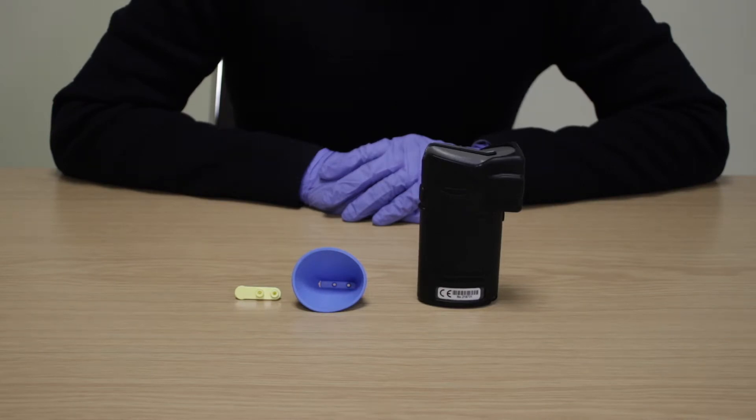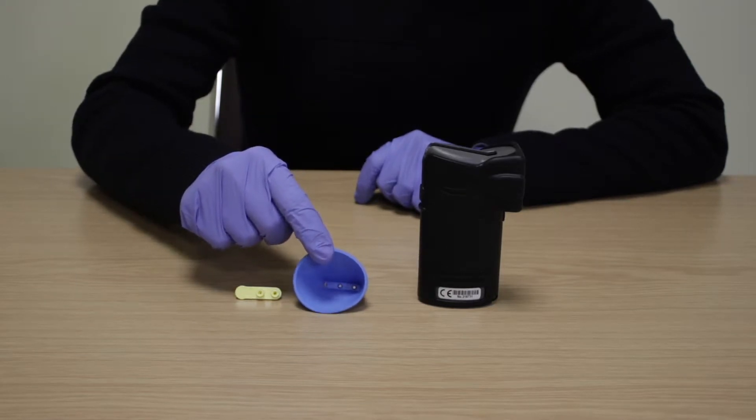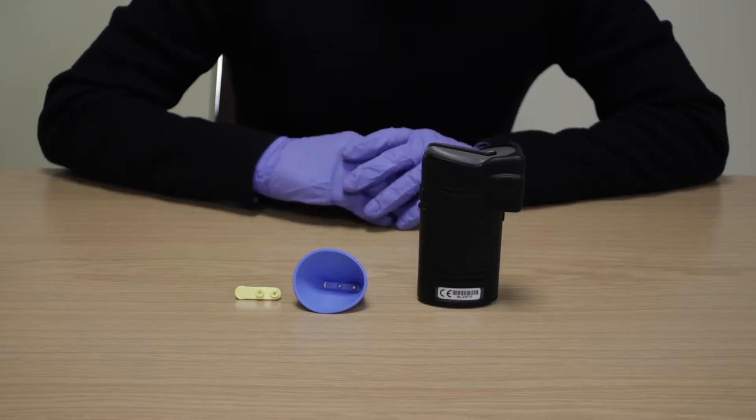Welcome to our products and user guide videos. Today we are going to demonstrate how easy it is to take a passive breath test on the Intoximeter AlkaSensor FST Breathalyser. There are two ways to use a passive test mode: a directed passive test using the breath sampling cup, and a drink sniffer test using the drink headspace sniffer attachment.